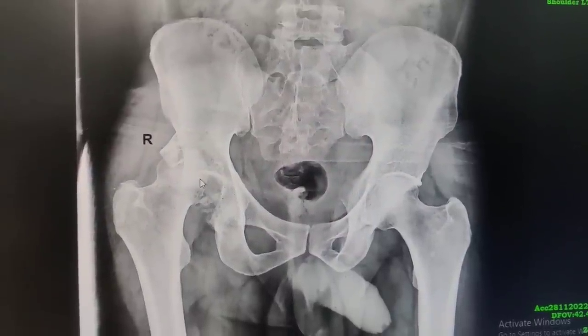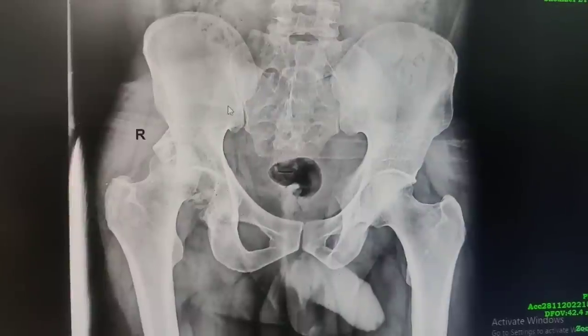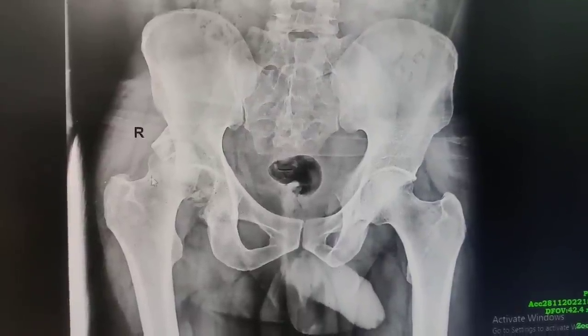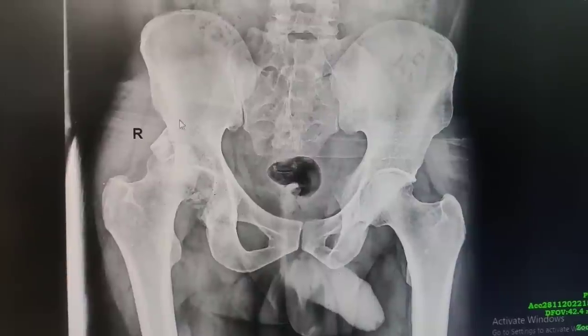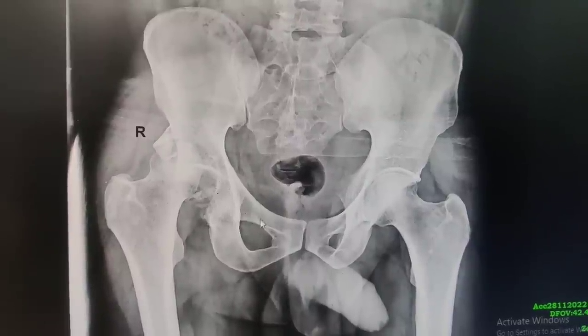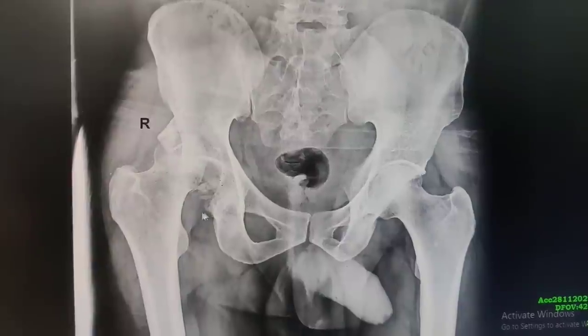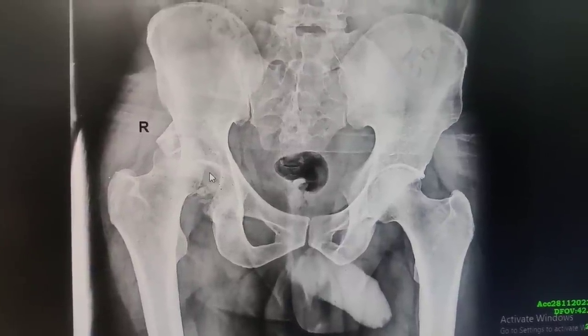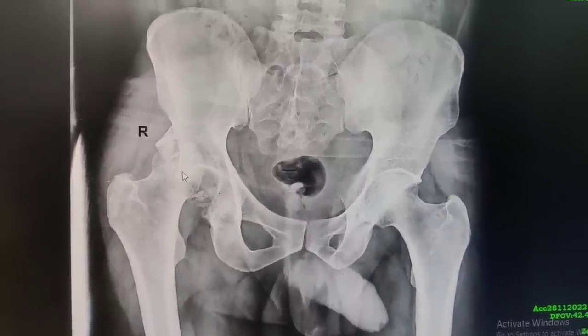Our patient has a history of road traffic accident and you can see he has a subluxed right hip. There is a posterior superior wall fracture and there are small incarcerated fragments into his acetabulum. Our goal today is to remove this incarcerated fragment, see if it is fixable to fix it, and then do a posterior wall reconstruction.